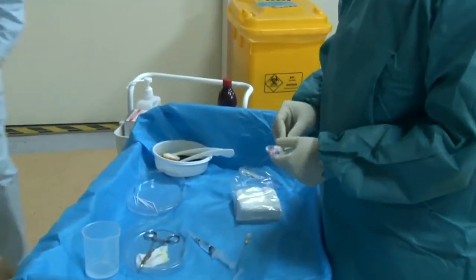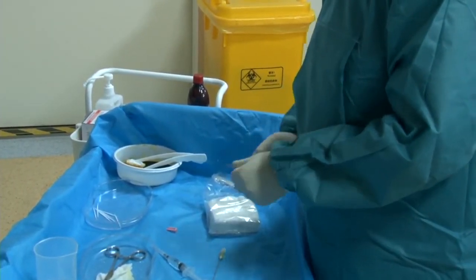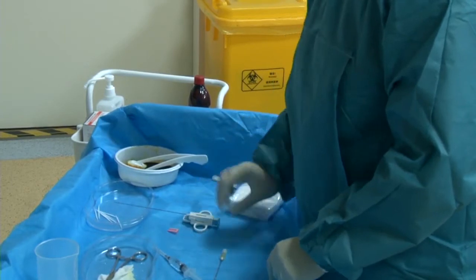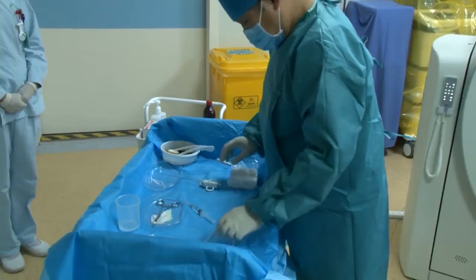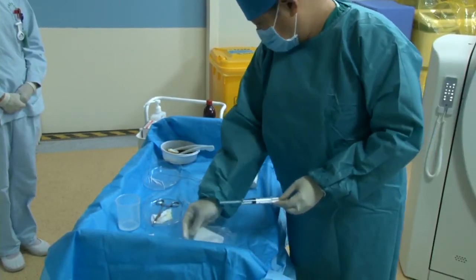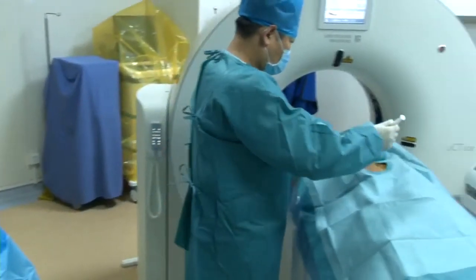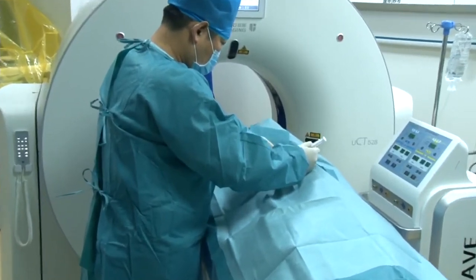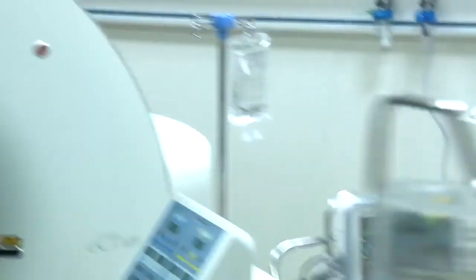This is a biopsy automatic or semi-automatic needle for the biopsy, correct? Yeah, correct. This is a biopsy needle. Actually, this is a semi-auto biopsy system, biopsy needle. But still, the first step is local anesthesia.